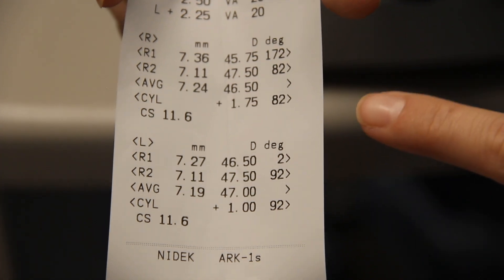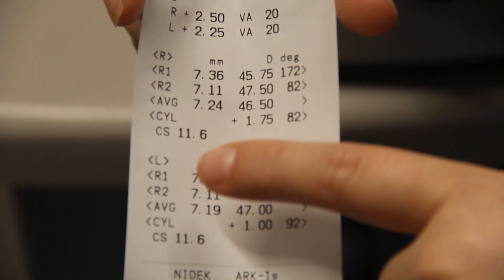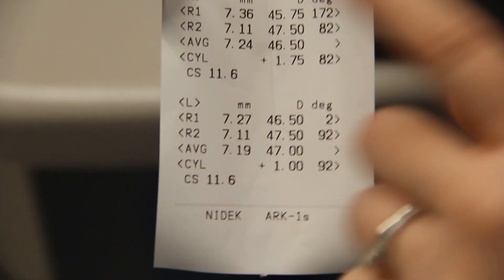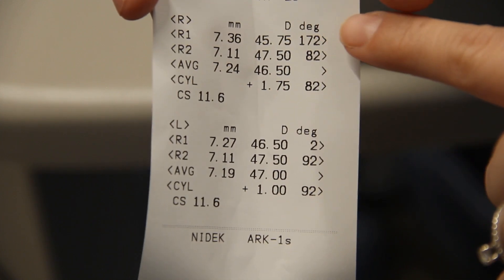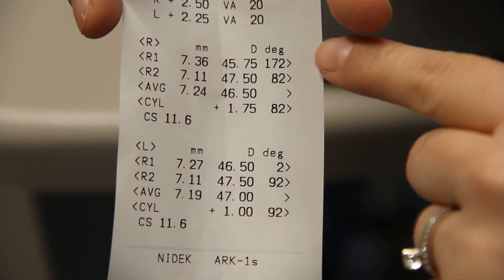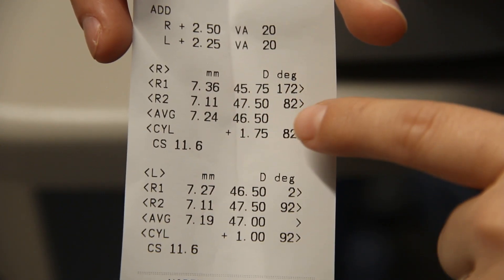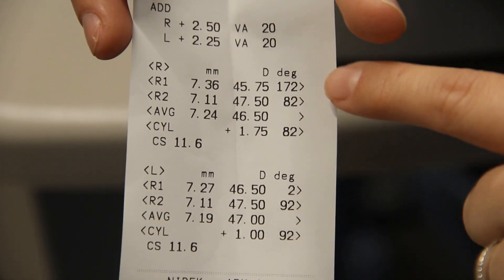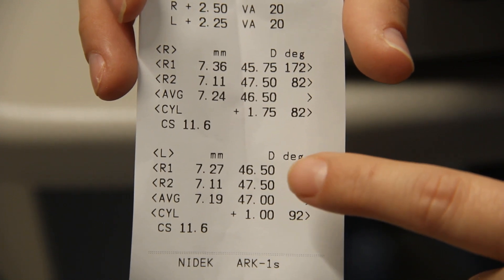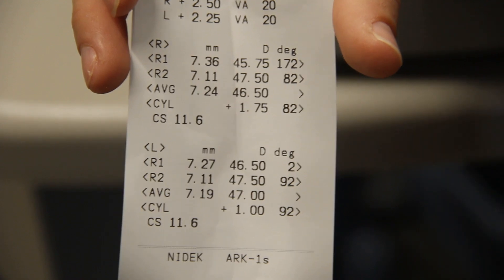The last section gives your K readings. Write both R1 and R2 for both eyes. Right eye: 45.75 @ 172, then 47.50 @ 82. Left eye: 46.50 @ 2, and 47.50 @ 92.